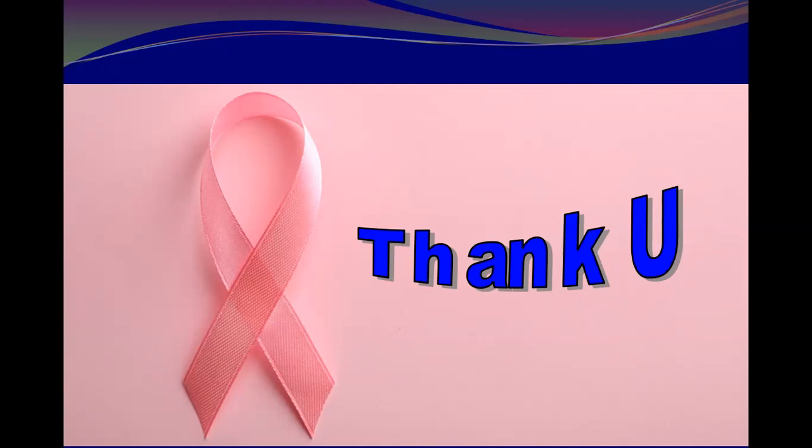Okay. And regarding the fibrous ridge, you can see it anywhere in the breast. What is the fibrous ridge? You have seen now two examples of fibrous ridge. It can be sharp, meaning the parenchyma sharply tenting, or it can be humping, or it can be a focal area of fibrosis like this.